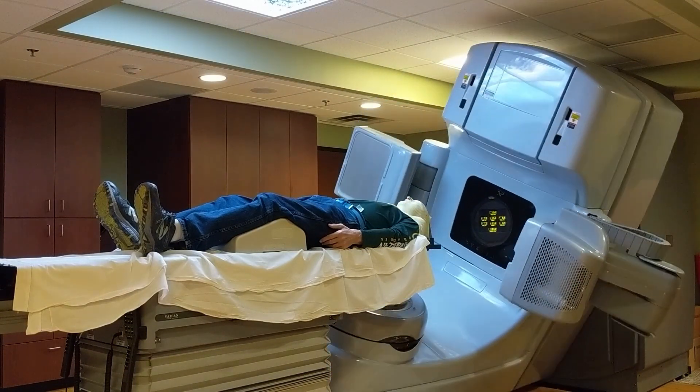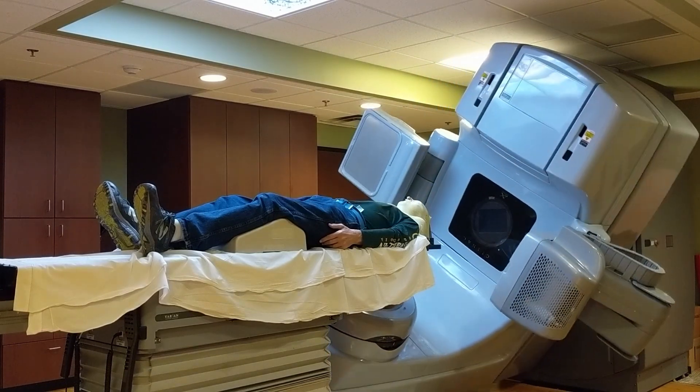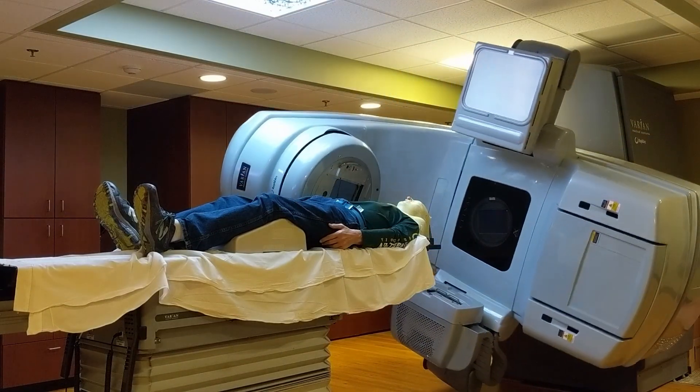Once the pins are set, the device gets in position, and I'm actually receiving the photon radiation at this point for about 20 to 30 seconds.